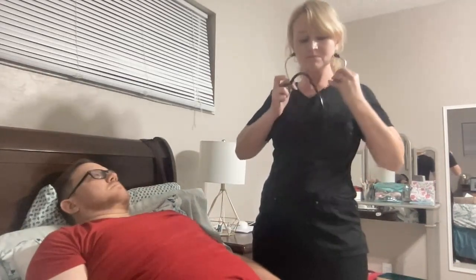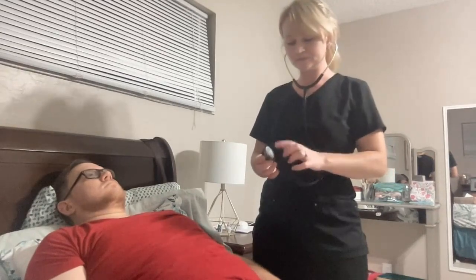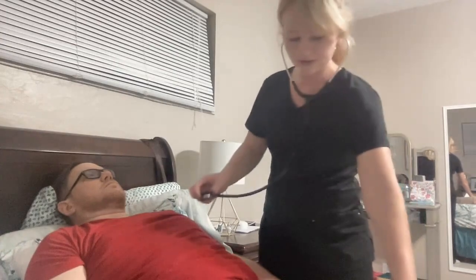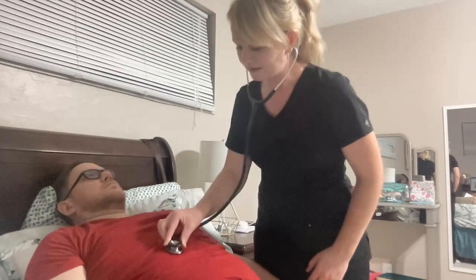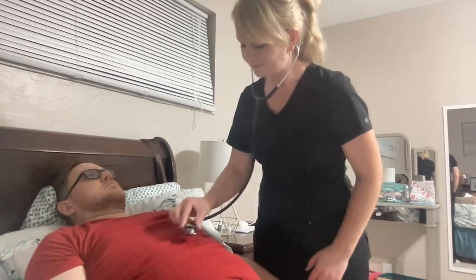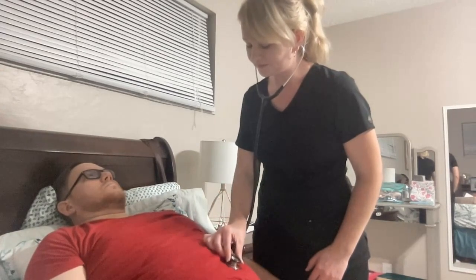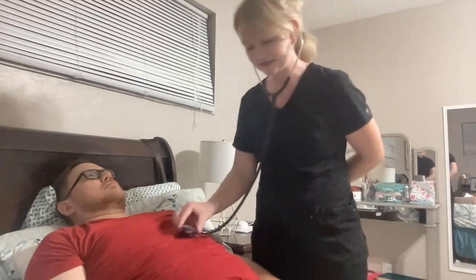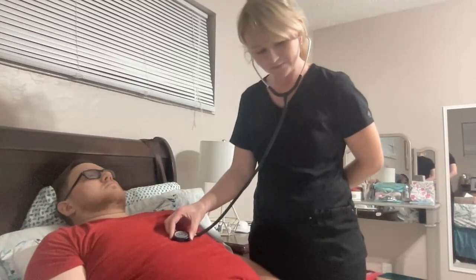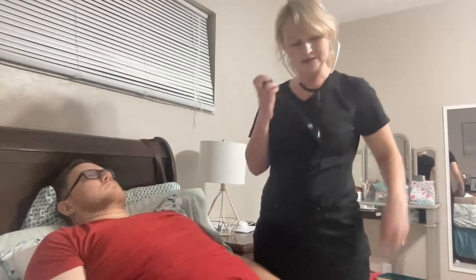And now we're going to auscultate in all four quadrants. Okay. We're going to go with the right lower quadrant first. Right upper quadrant. Left upper quadrant. Left lower quadrant. Good. And I'm also going to listen at the aorta with the bell of my stethoscope for any bruits, and none are noted.